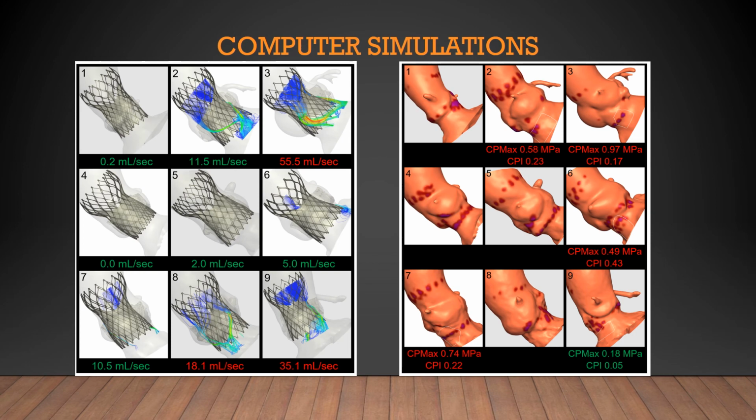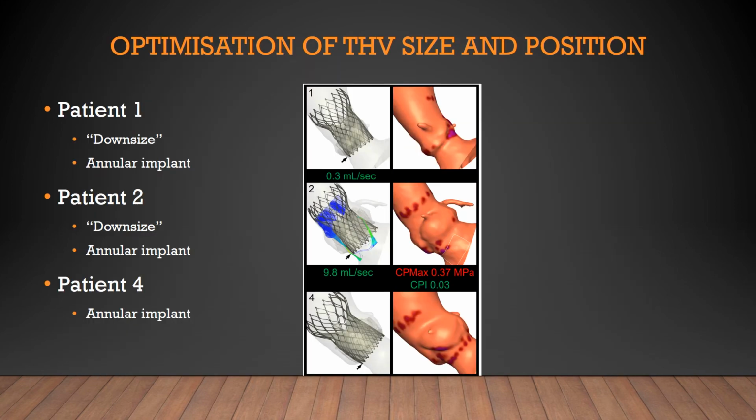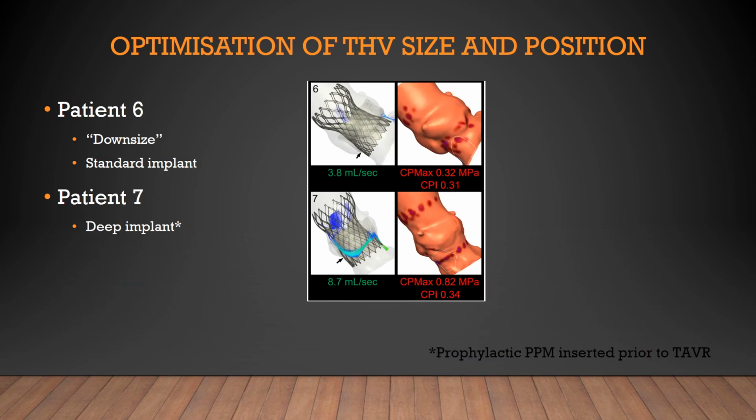Now, this technology, as per the presentation given by Dr. Dowling, is only available for the self-expanding prosthesis. They apparently cannot do it for the Sapien valve. Maybe they're doing it now and I'm not aware of it. But as this computer simulation with actual valves becomes more available, I think we will be able to implant our valves in a much nicer fashion and choose our percutaneous heart valve based on the CT sizes and dimensions and so on and so forth.